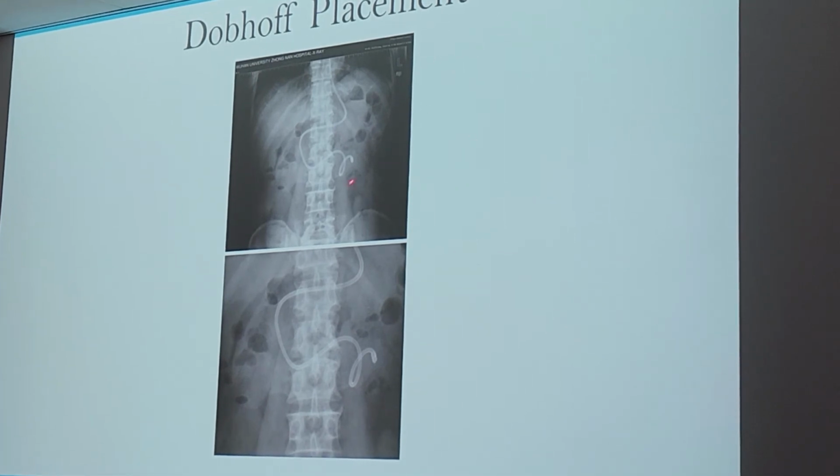So sometimes when we take x-rays, it might look like this. Some sort of kink is happening in the Dobhoff. So most likely, guess what? You will be called back for that x-ray in an hour, because they will be readjusting this.